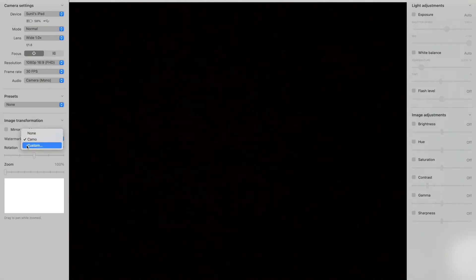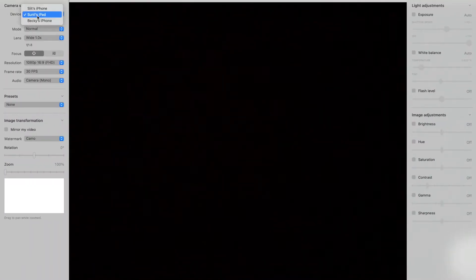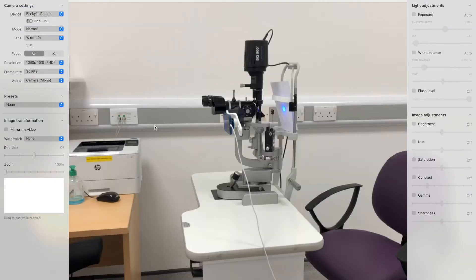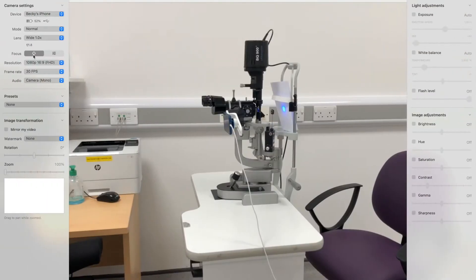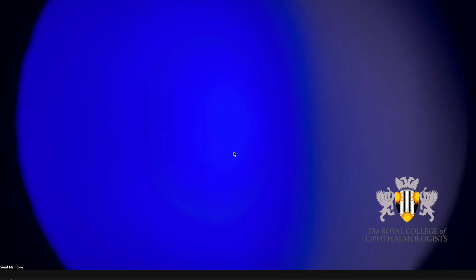There's also an option to add a watermark. This is the view through Zoom, and we can see that when we change the device in Camo, it reflects straight away in Zoom without the need to change any settings in Zoom, making it very easy to behave as a director.